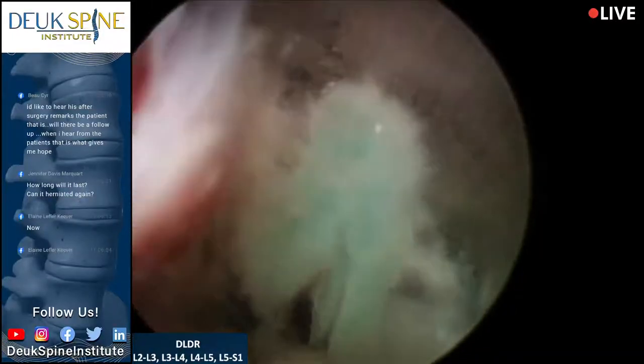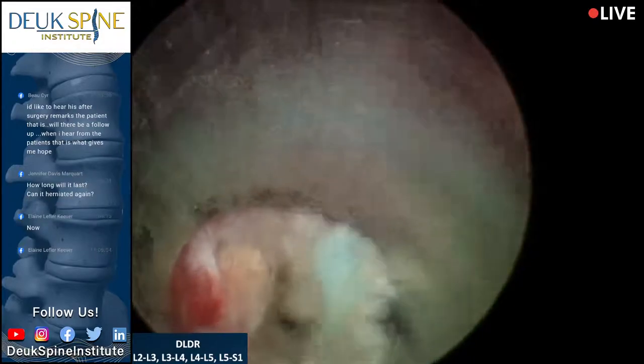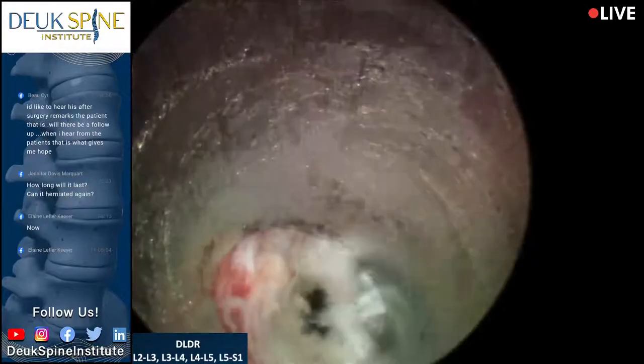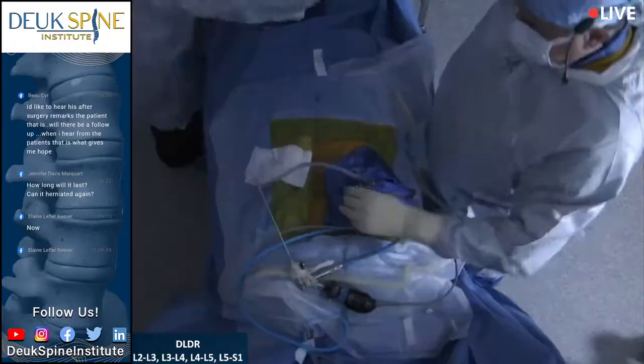All right, give me the grabber. I'm going to get that last piece of herniation out. We're done. You can see the tear is already coming back together now that I've gotten the herniation out. Take scope off, please. Thank you. All right, great questions from the audience.